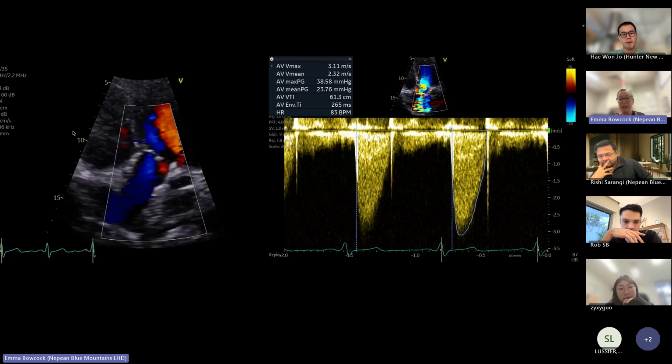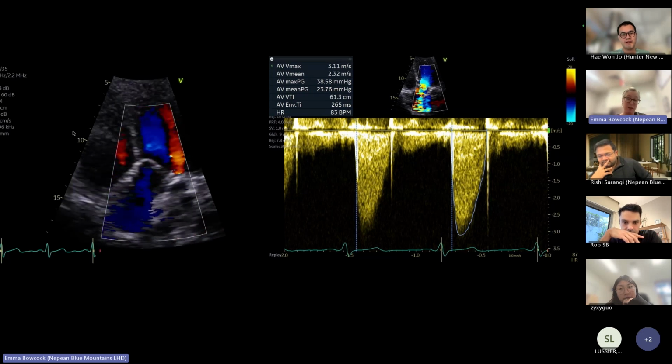But then we get to this part, and I think it's probably, Rob, how many bicuspid aortic valves have you assessed?